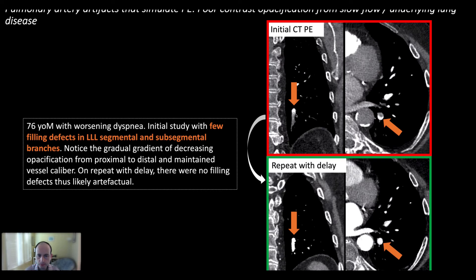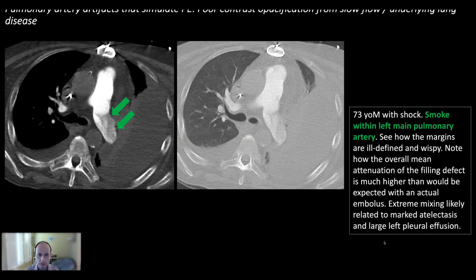In another example, contrast opacification starts very bright and then slowly tapers distally. On the axial plane you can see almost a fluid level, where contrast is dependent and non-opacified blood is anti-dependent — another typical manifestation of mixing artifact. Again, a repeat with delay shows that it has resolved.